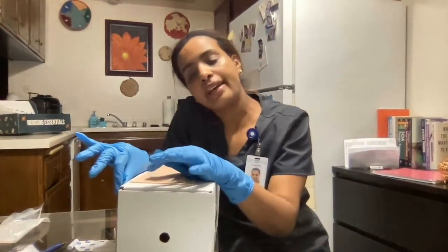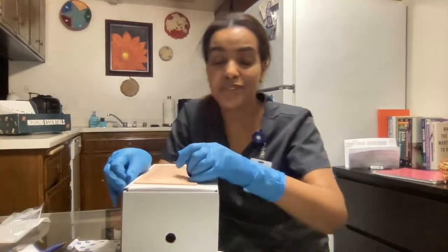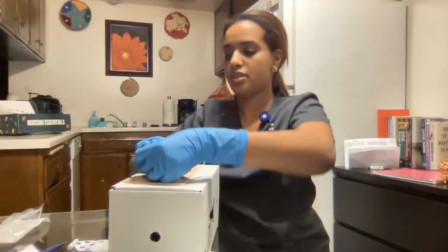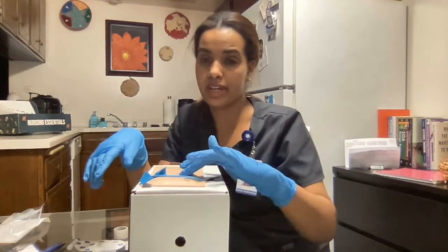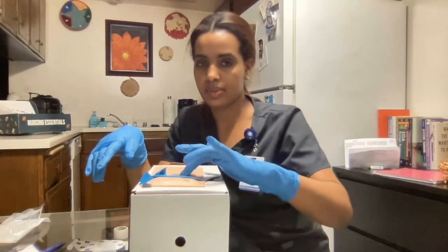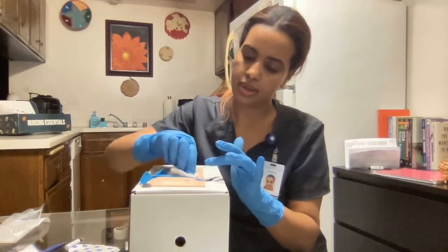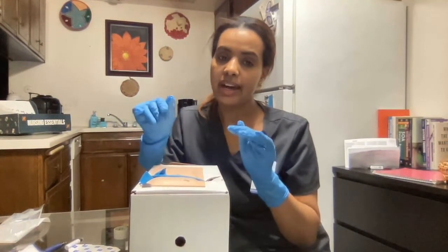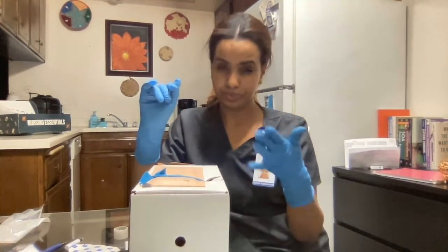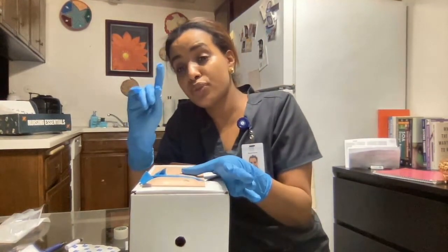After that, I'm going to grab my IV tubing extension, open it, and then open my pre-filled syringe — this goes to trash — and connect them. Then I'm going to go ahead and prime to remove the air. Okay, this is good.